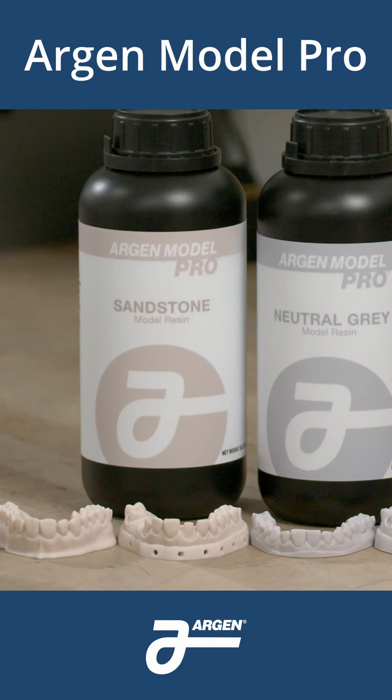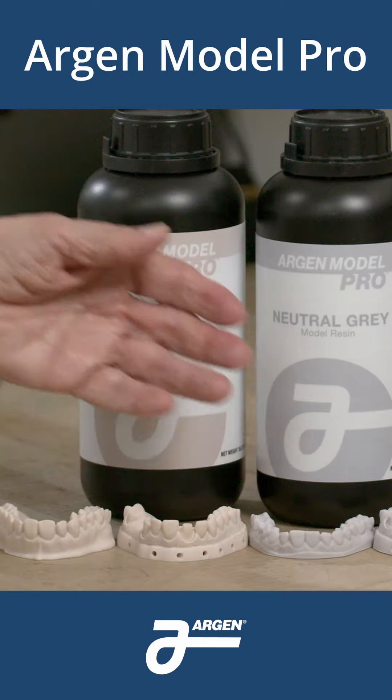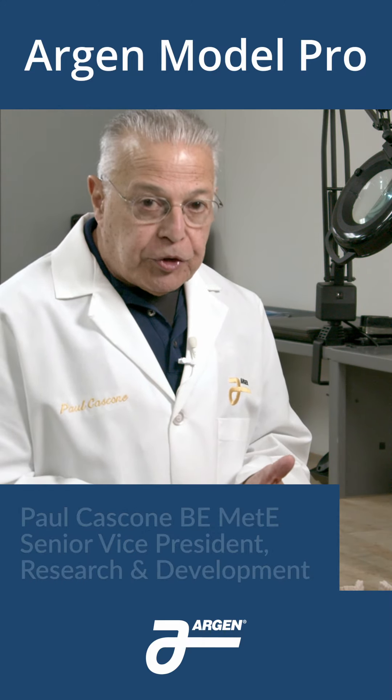I'm standing in the 3D model printing room of the Argen Digital Center to introduce a new product to you: Argen Model Pro, a resin for models. This material can be used for a wide variety of printers.